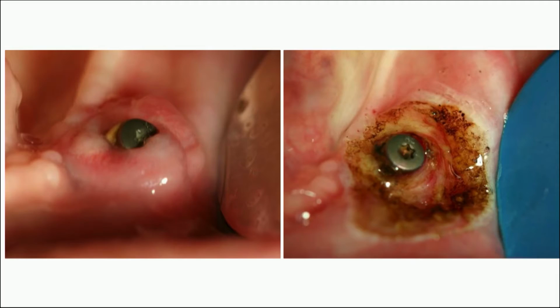We've used this a lot in our oncology patients who've had implants where the tissue around the implants has been a skin graft rather than oral mucosa, and it often proliferates badly. So rather than graft those, we've been able to use this laser treatment to create a keratinized bed that patients can clean against very, very well, rather than more delicate mucosa. A new procedure that really came about because of lasers, I guess.